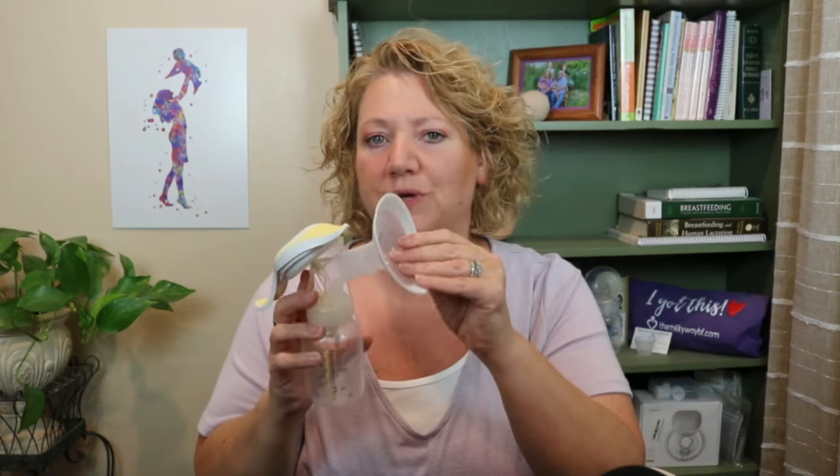Check your own pump's directions, but most are dishwasher safe. Most manual pumps only come with one size of flange — the Medela comes with a 24 — so it only works if you happen to be that size. With any pump, your flange size isn't determined by how large your breast is; it's how wide your nipple is.